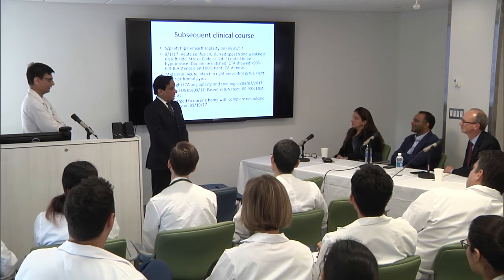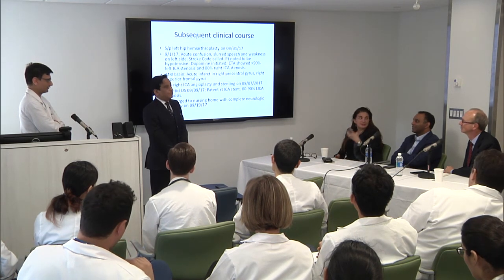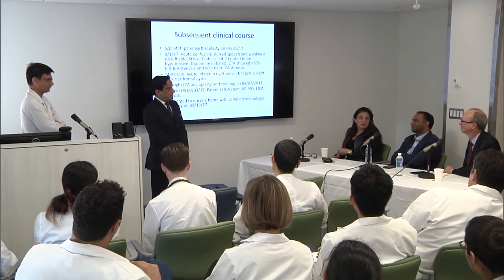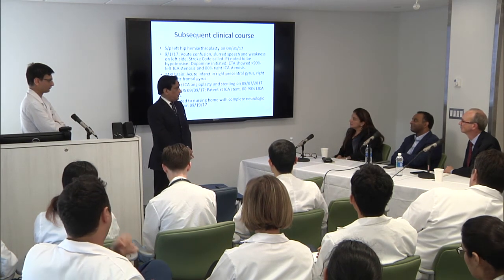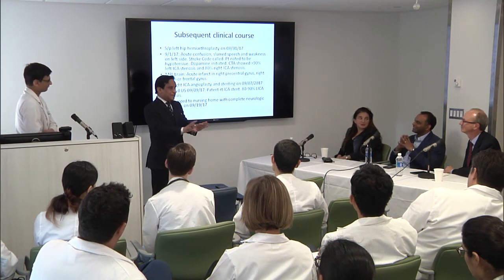That's great. The stent made a very rapid recovery for her. The patient was in the CCU with acute stroke and did very well. Rapid recovery with the stenting in the carotid. Wow, it's a nice case. They did nice.